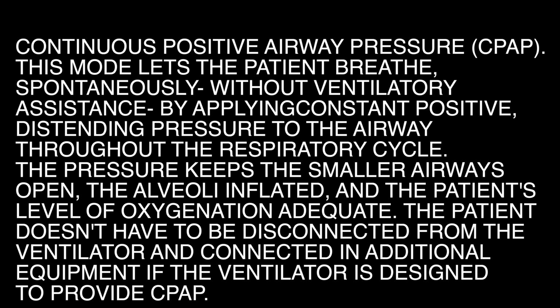Continuous positive airway pressure, CPAP. This mode lets the patient breathe spontaneously without ventilatory assistance by applying constant positive, distending pressure to the airway throughout the respiratory cycle. The pressure keeps the smaller airways open, the alveoli inflated, and the patient's level of oxygenation adequate.